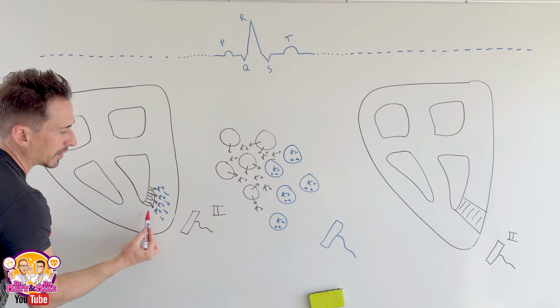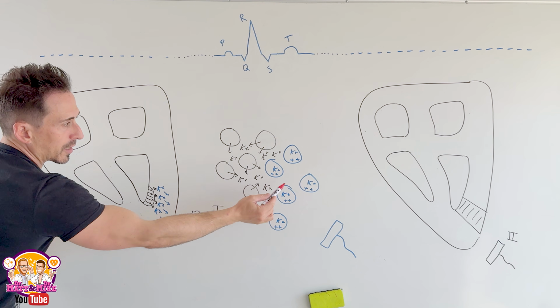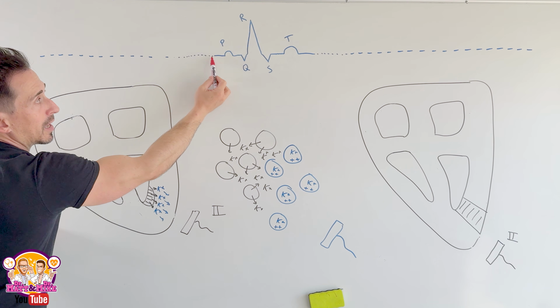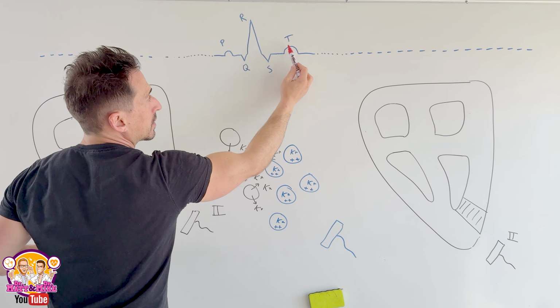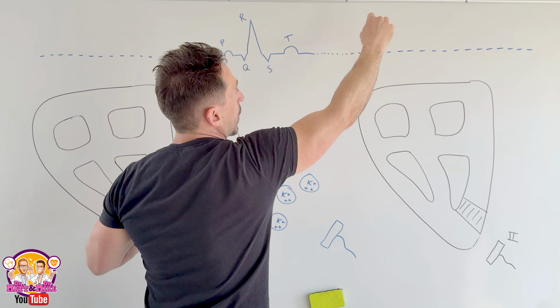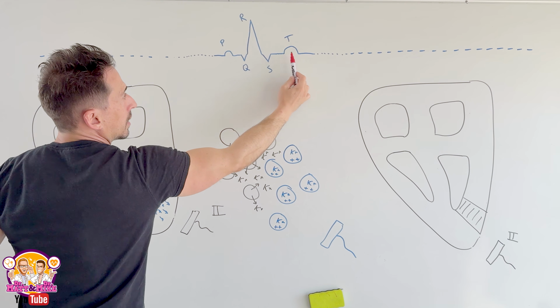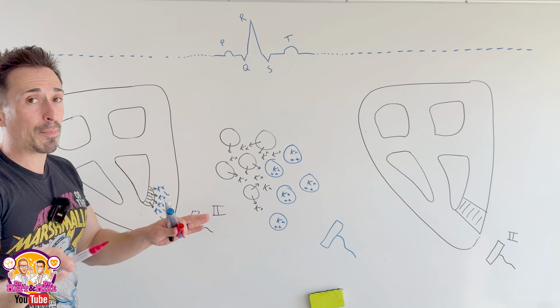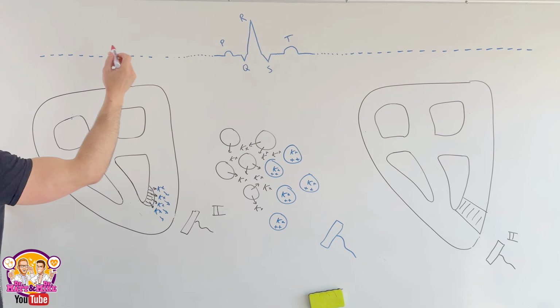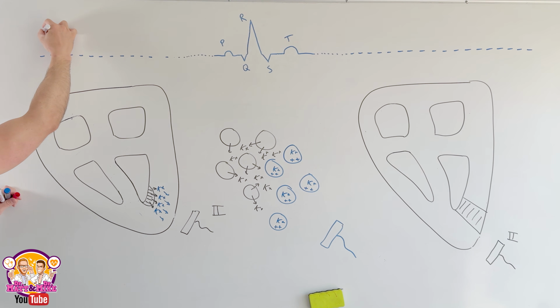In subendocardial infarct, these cells are depolarizing early here at what we call the TP, because remember, after the T wave, you then get a PQRS complex. The whole thing occurs over and over again. The T to P segment, when nothing's happening, this is what gets elevated, right? So we've got a new isoelectric point.